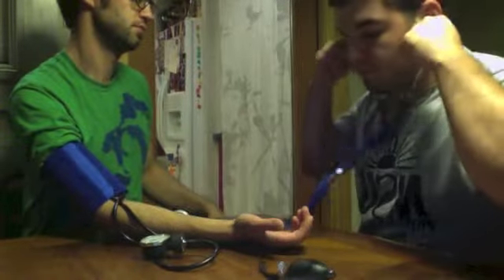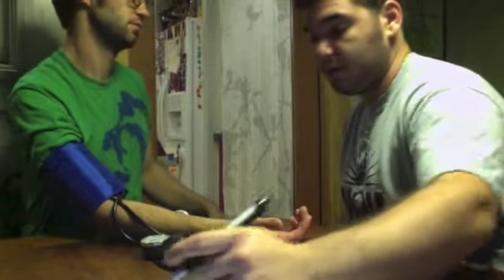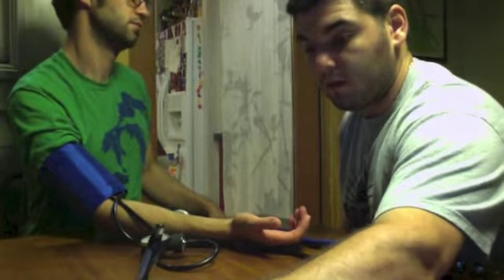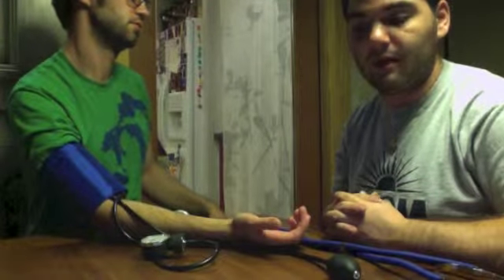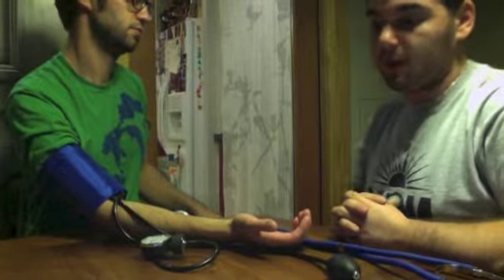And great. So the first trial, my patient's blood pressure was 110/78, which definitely falls well within the range of normal. Normal is about 115/75. So we're just going to take a few minutes to let his blood pressure stabilize, and then we're going to do a second trial.